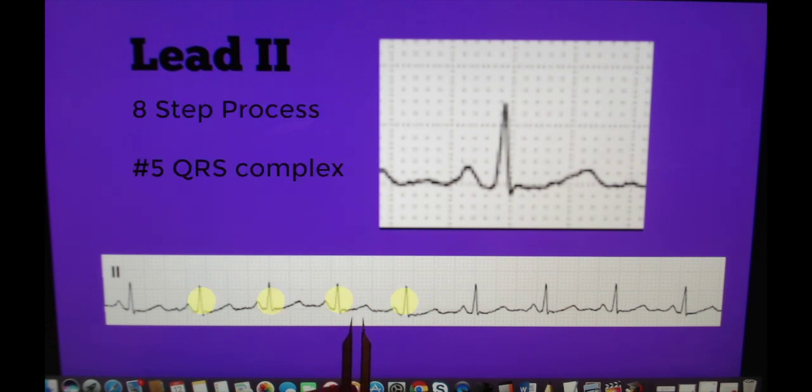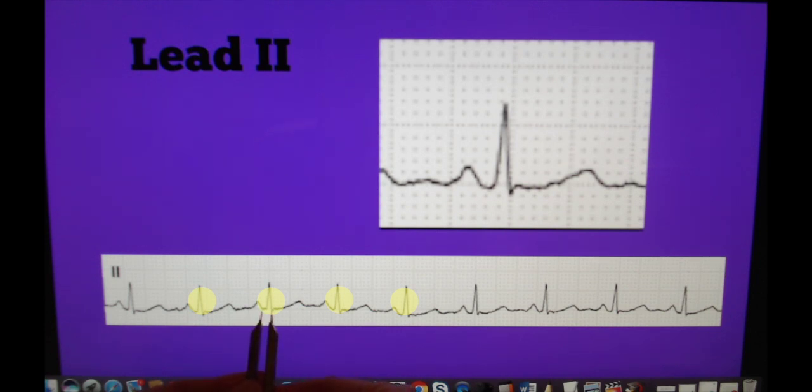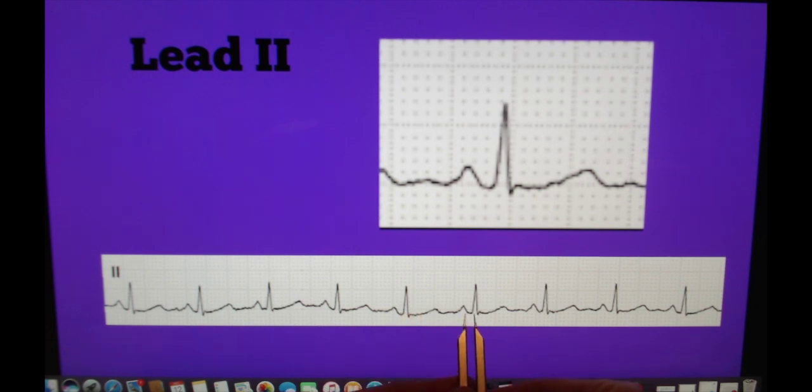In step five we are going to assess the QRS complex. Again using our calipers and measuring all of the QRS complexes on this strip, we find that we have two squares which is equal to 0.08 seconds, within our normal range.